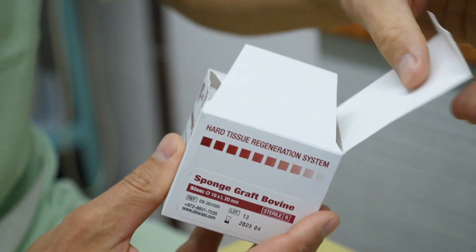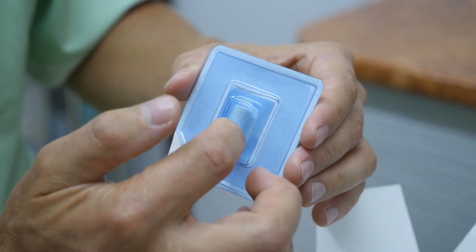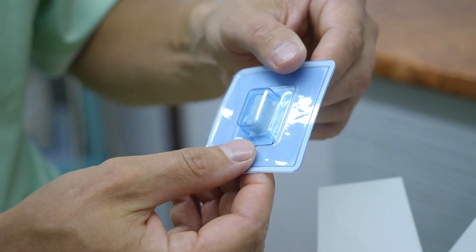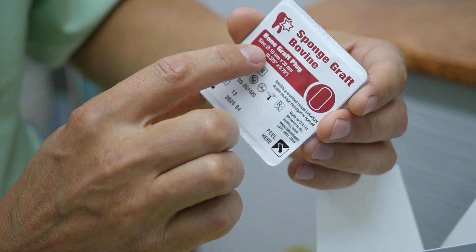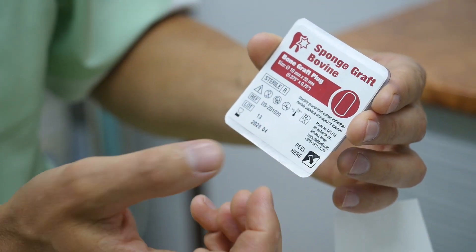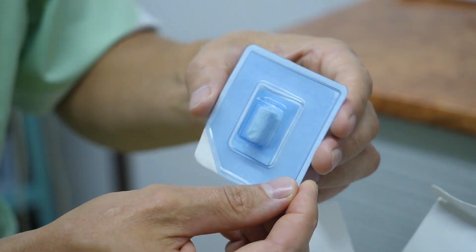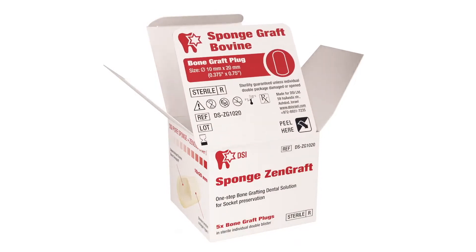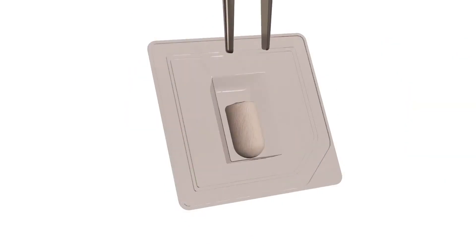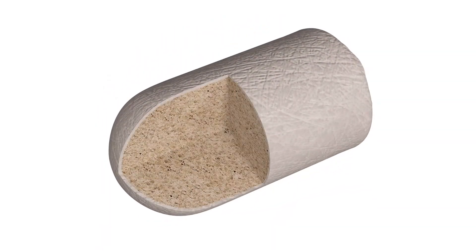DSi SpongeZenGraft is a winning combination of two top-rated products: SpongeGraft Collagen Plug and Xenos BoneGraft. It is a two-phase composition of bovine tendon collagen type 1 impregnated with deproteinized bovine xenograft. The contained hydroxyapatite promotes revascularization and stabilizes blood clots, while the collagen provides high particle adhesion. The plug shape makes it easy to place into extraction sockets or other bony defects.